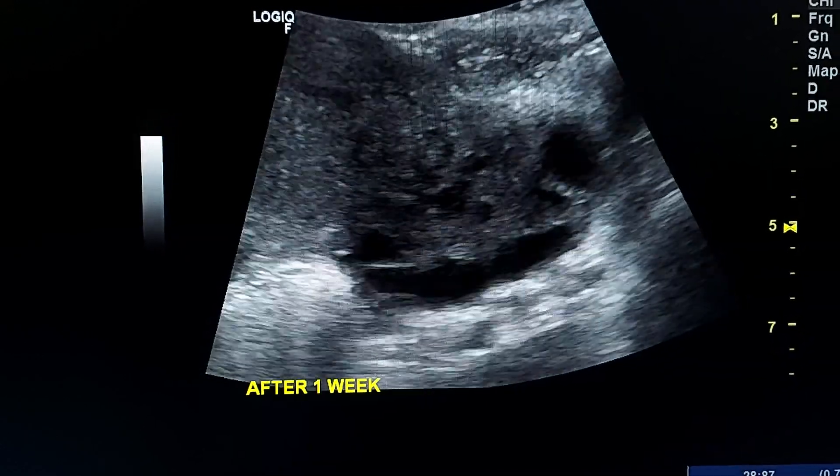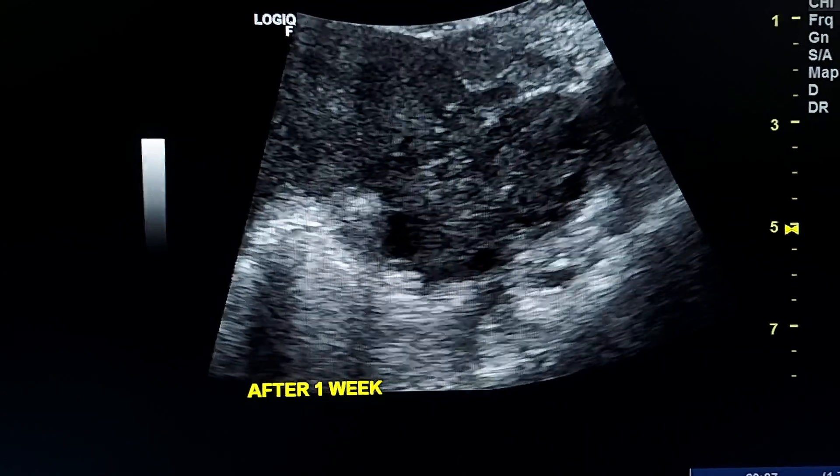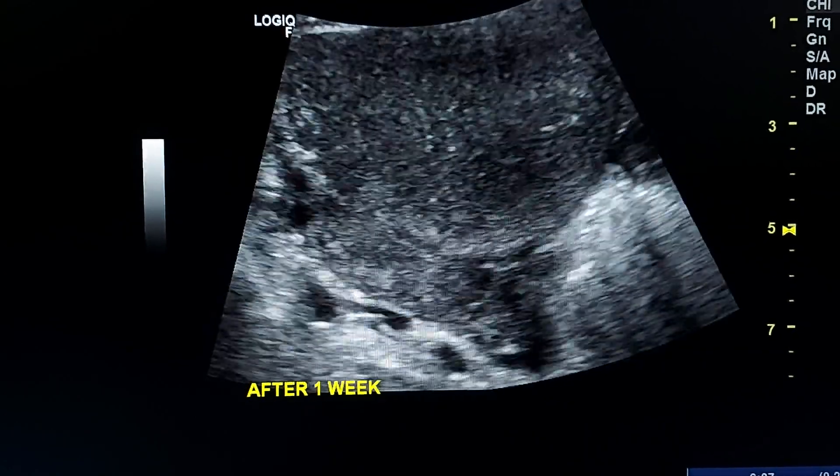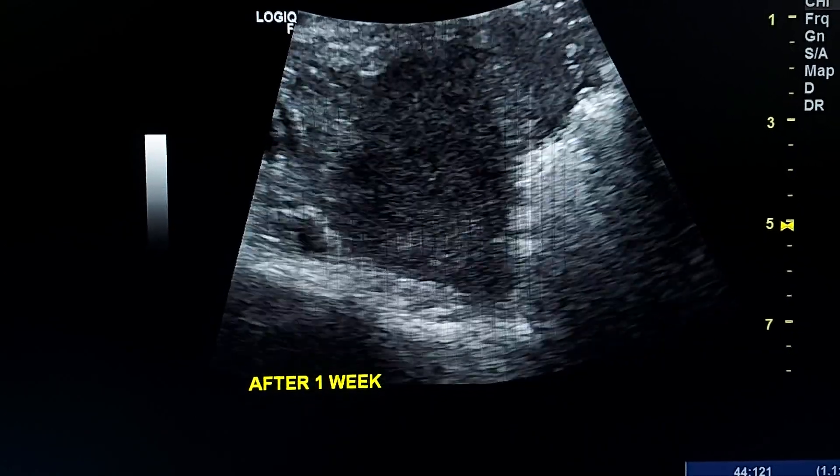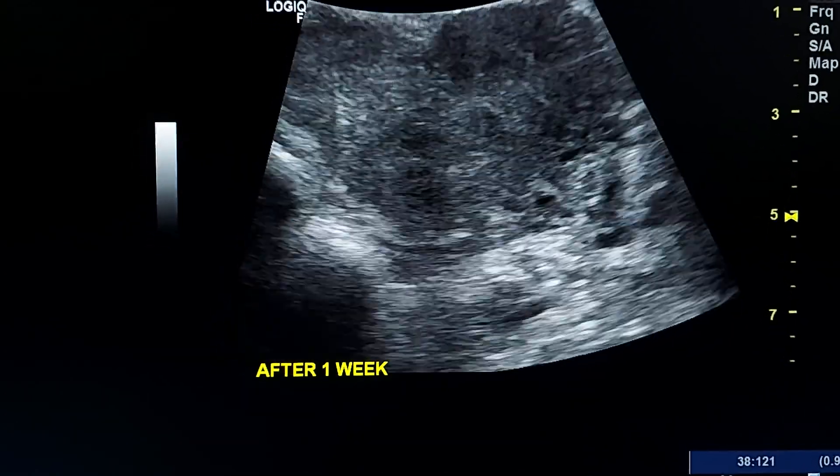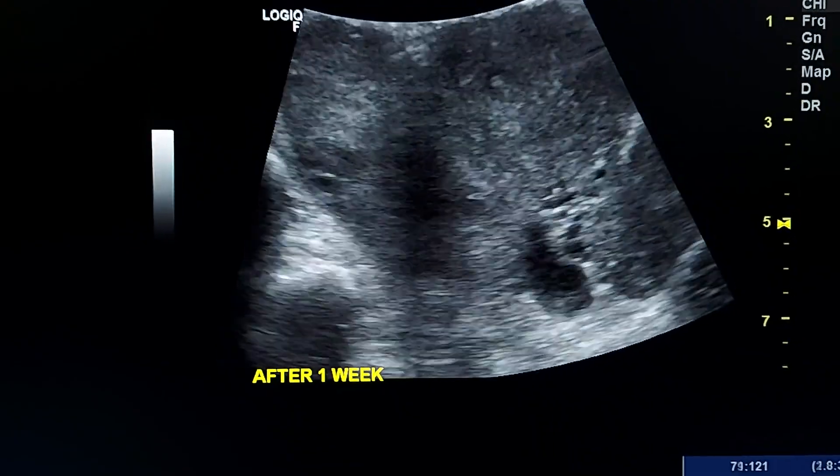The right ovary will be less enlarged. This is the left ovary for comparison.